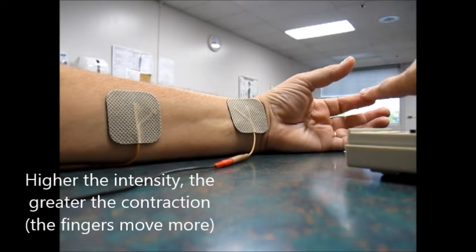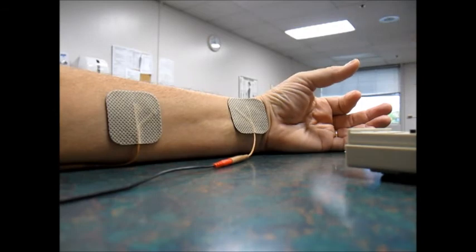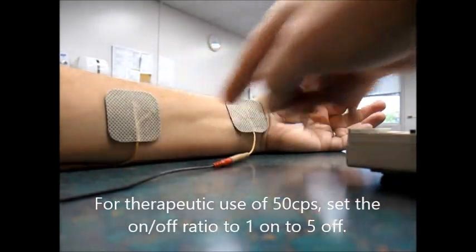I can resist this, it's not easy. There's a big contraction going throughout his whole arm right there.